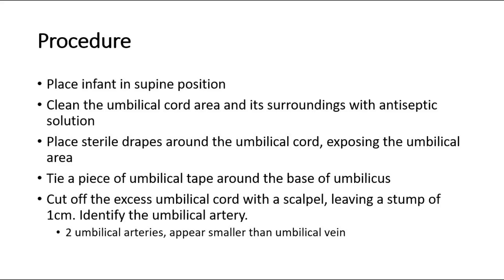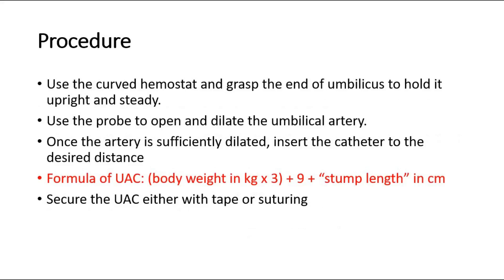We also have to identify the umbilical artery. There will be two umbilical arteries, and they appear smaller compared to the umbilical vein. Next, use the curved hemostat and grasp the end of the umbilicus to hold it upright and steady. Use the probe to open and dilate the umbilical artery. Once the artery is sufficiently dilated, insert the catheter to the desired distance.